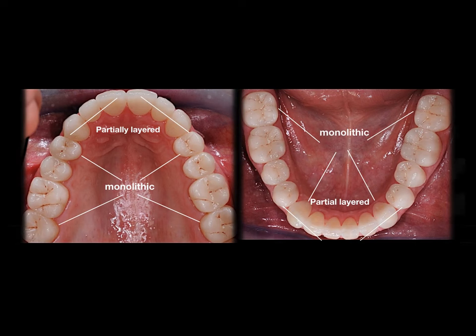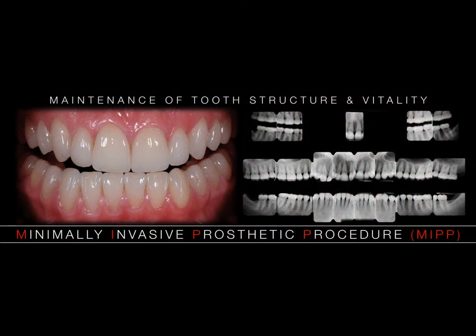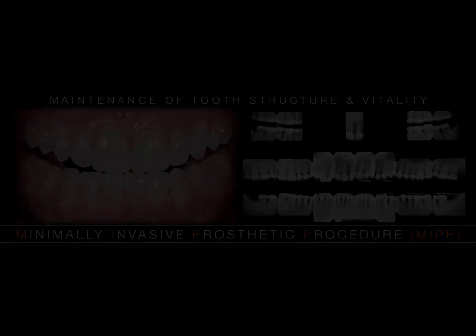The final result is also highlighted by this picture. I'm not talking about the colored picture. I'm talking about the black and white picture that shows you that no one tooth was treated endodontically. And that is something that is really not usual to find, or at least it was not usual to find in the past. So that is the best result that you can achieve, helping the patient that is in a difficult situation. Not just giving back to her an aesthetic result, but also to really create a biological integration on the pulp maintenance, but also on the gingiva outline.